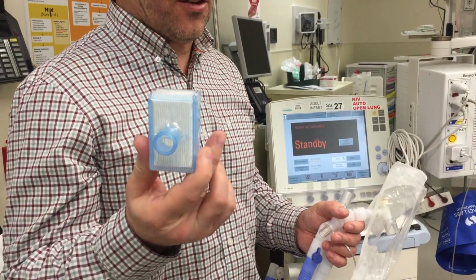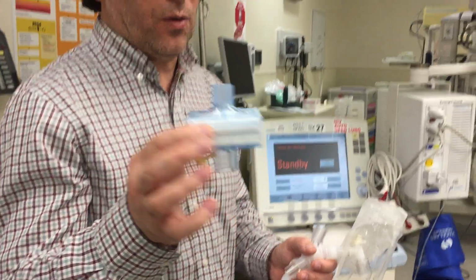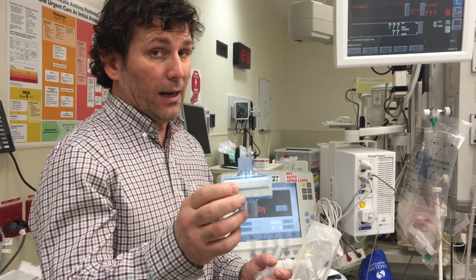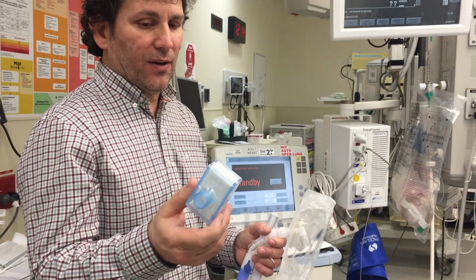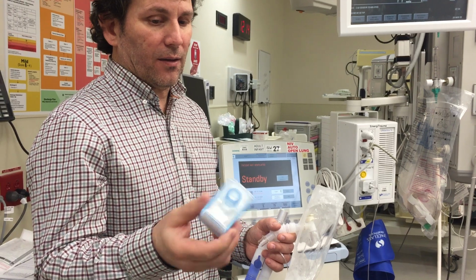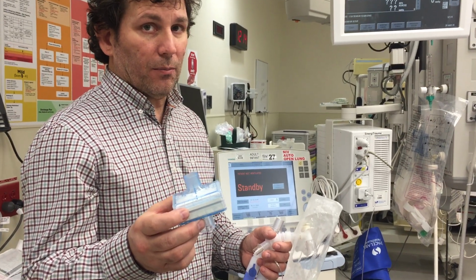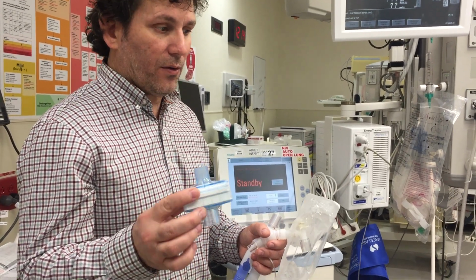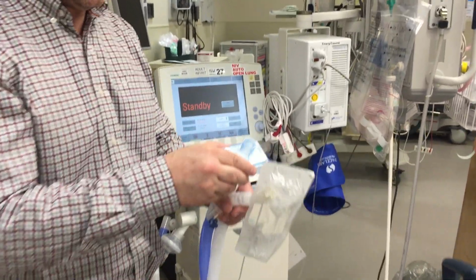This provides humidification to the patient because we don't have an active humidifier on this ventilator, and we typically will go this mode with all patients for about 48 hours, and then we'll switch them over to active humidification. So this passive humidification device does do that. It will also screen out COVID-19 and most every other bug that we know of at this point in time. Okay, so for COVID-19, this is considered safe. We want to make sure that's always on.